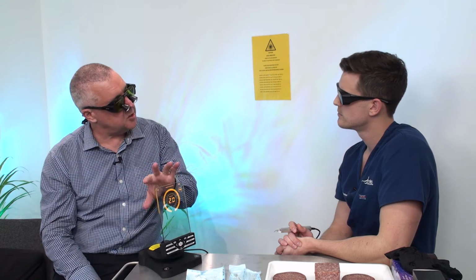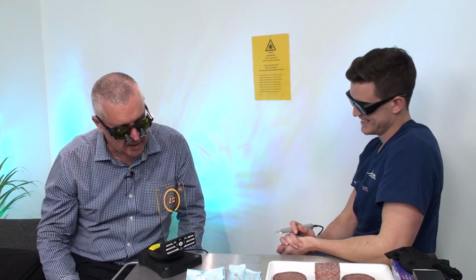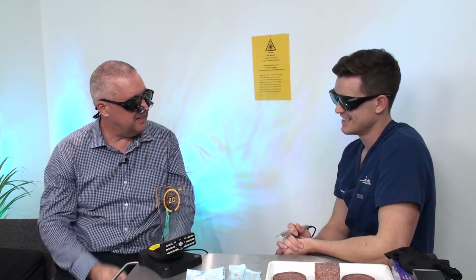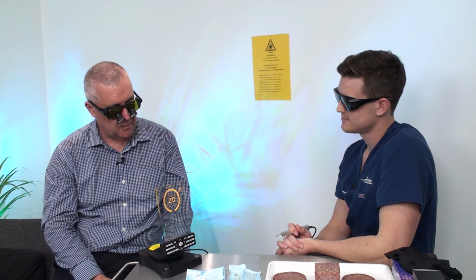I found that some of my patients like the voice, particularly if they're Star Trek fans, because they recognise it's the same voice, because it's Majel Barrett, and other patients don't really go for the voice, so I switch it off. Yeah, it can get a bit loud. And you can obviously change the volume over there as well.